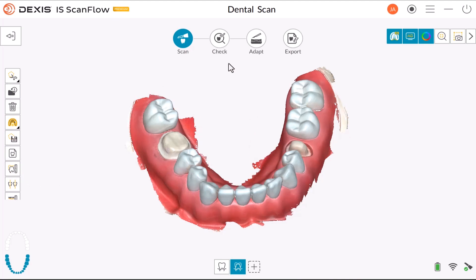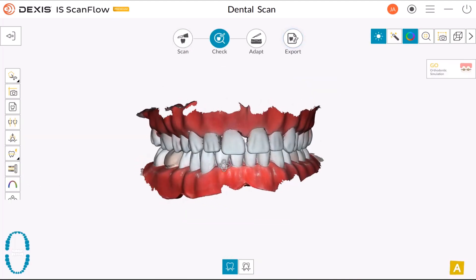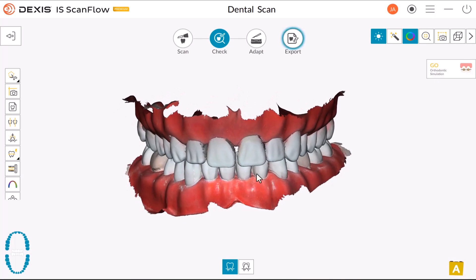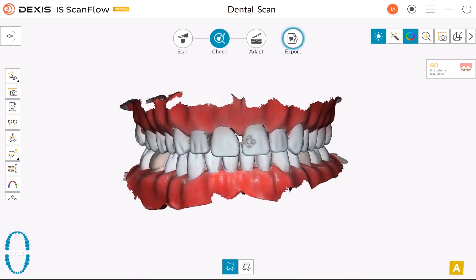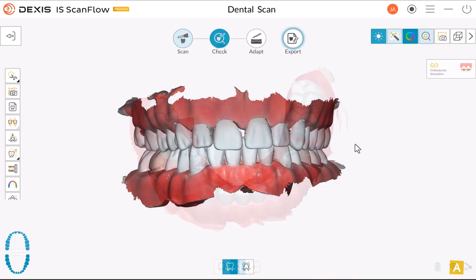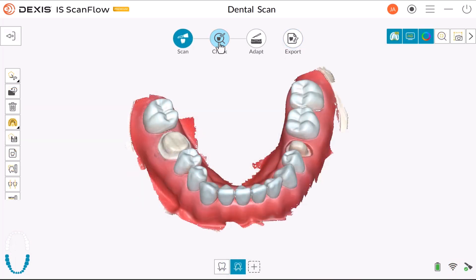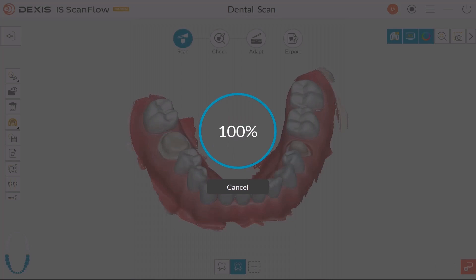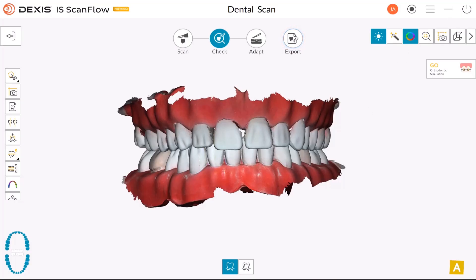Select the check step. If you are not satisfied with the scan quality, click Rescan to return to the scan step and obtain additional scan information. If you are satisfied, select the check step. Click on a Resolution Type and click Refine. The refined image is displayed.